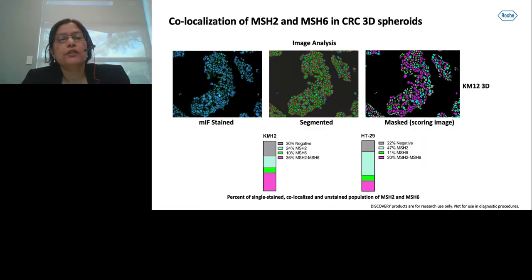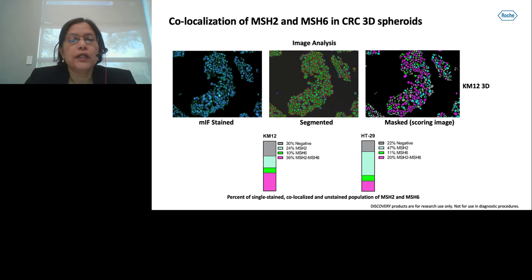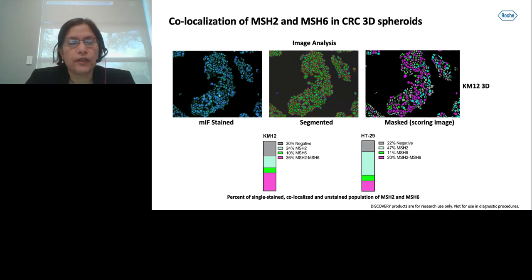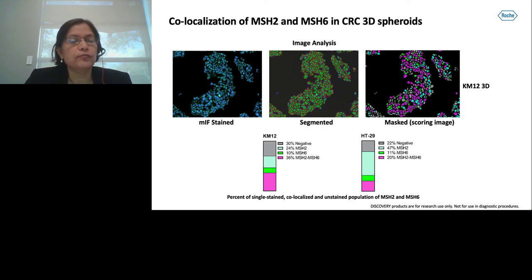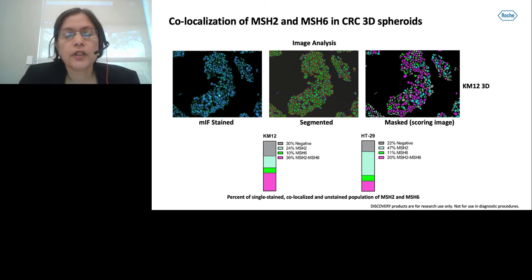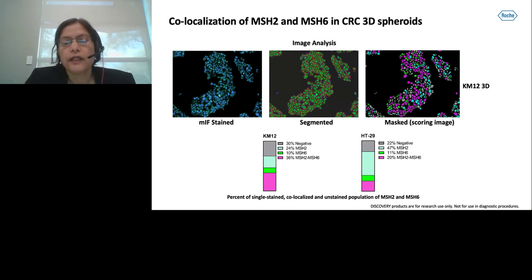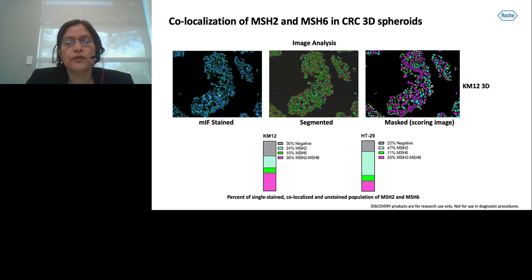Finally, we used the co-localization mask to look at MSH2 and MSH6 single and dual expression in CRC 3D spheroids. Here is an example of multiplex IF showing the segmentation and the segmentation mask in KM12 3D spheroids. The graph clearly shows that MSH2 expression was significantly higher in HT29 compared to KM12, even though co-localization of MSH2 and MSH6 was higher in KM12 versus HT29.